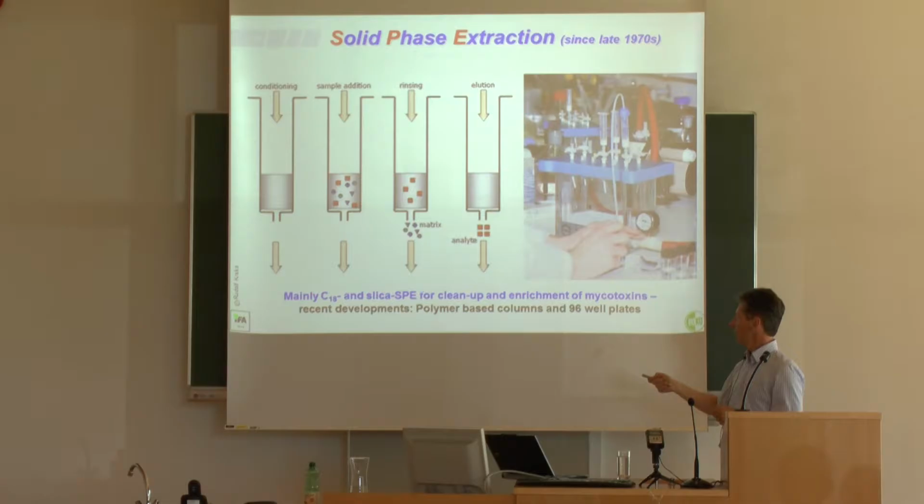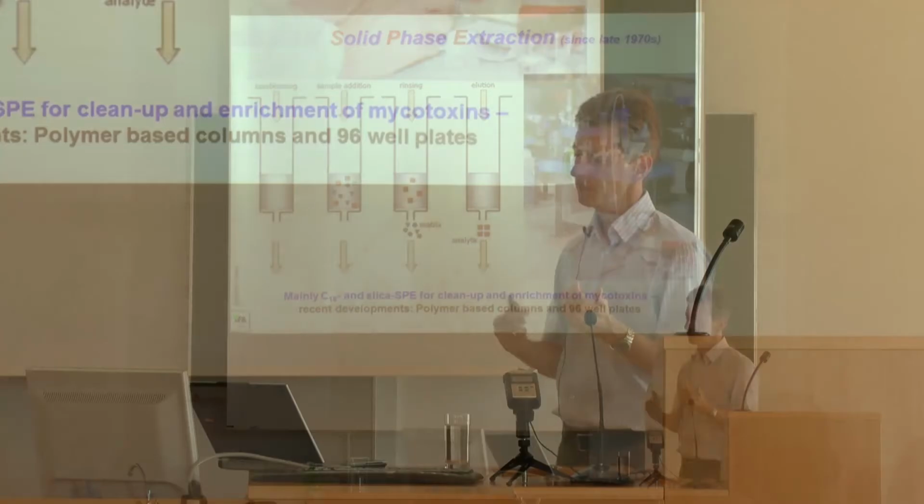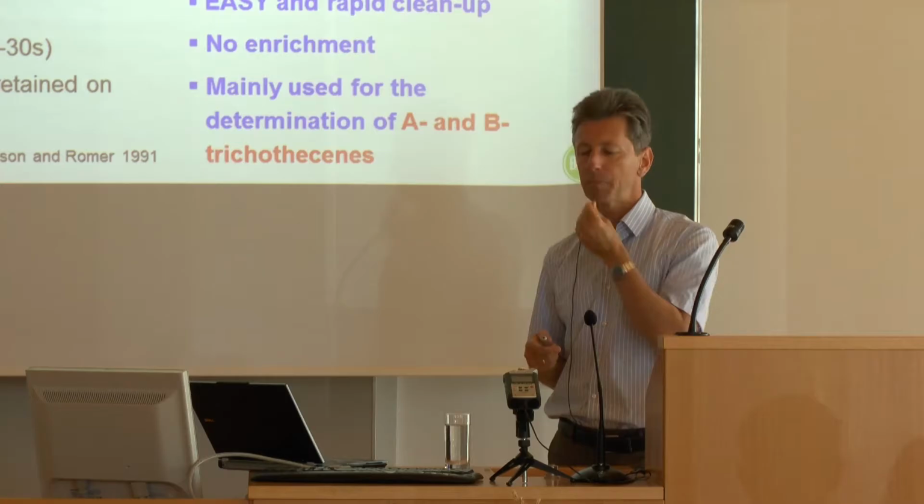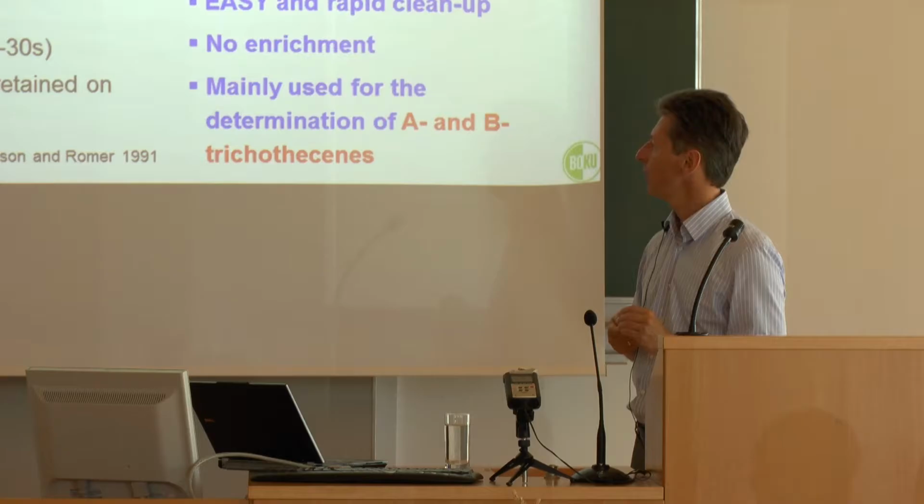Nowadays, polymer-based columns, even integrated in 96 well plates, are on the market, which already have an integrated solid phase extraction material. This is a cleanup method which is quite well known on this campus, because it's sold by Romer Labs. They have developed the so-called MycoSep column.